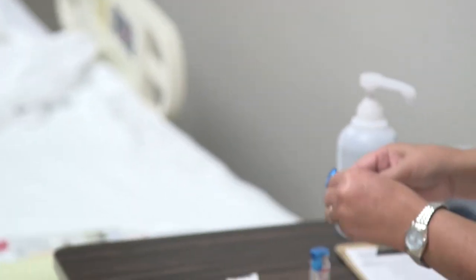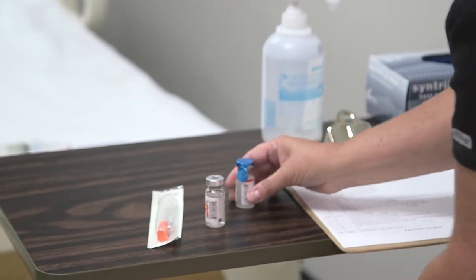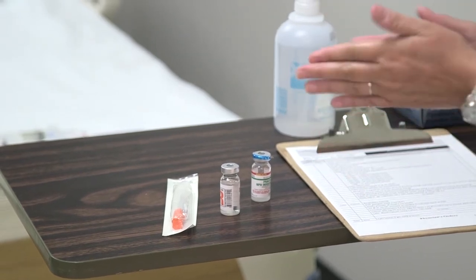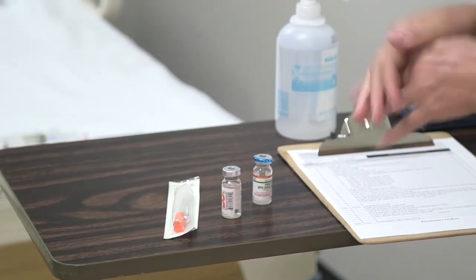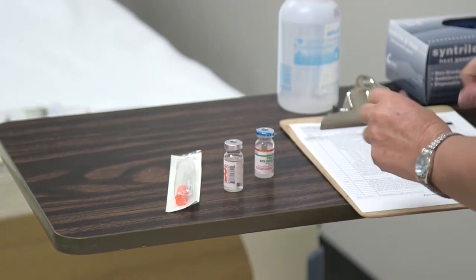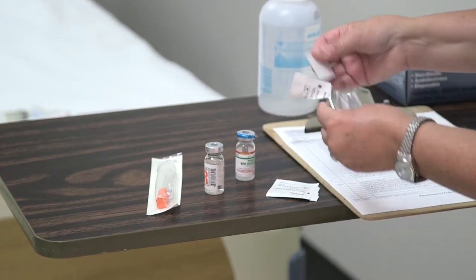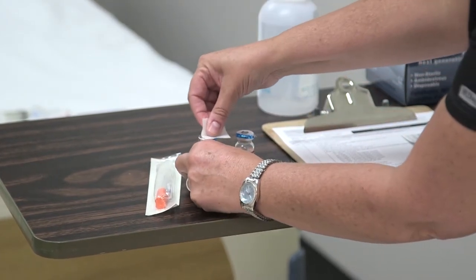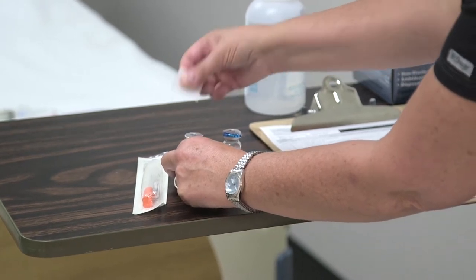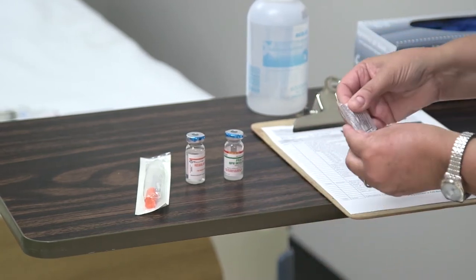We're going to open up our vials. If you haven't washed your hands, make sure you do before you get started, and make sure you have a clean surface to work on. I have my MAR in front of me and my alcohol wipes. We're going to do a vigorous scrub on each vial for a total of 10 to 15 seconds, using a separate alcohol pad for each vial.